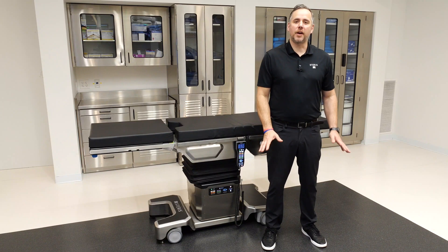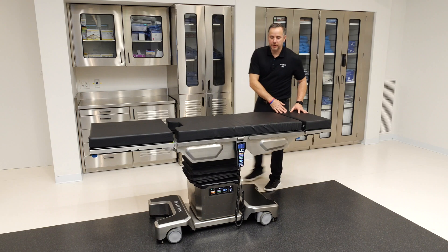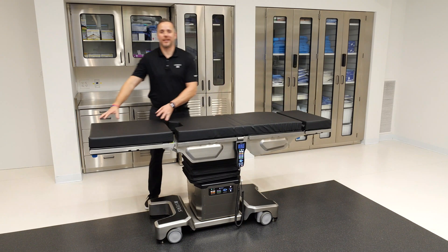Let's cover the tabletop. The 7080 offers a four-section tabletop: a head section, a back section, a seat section, and a leg section.